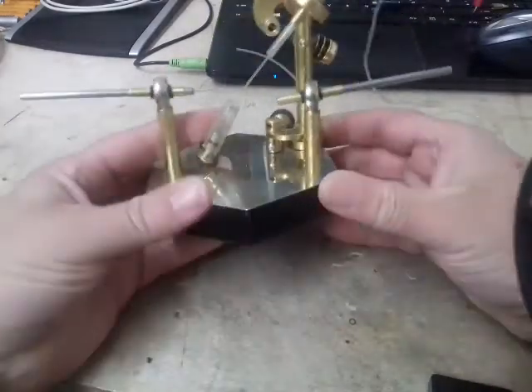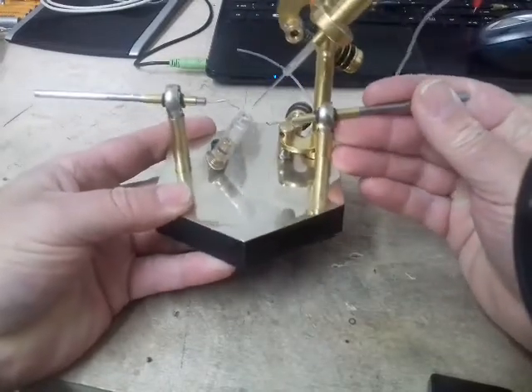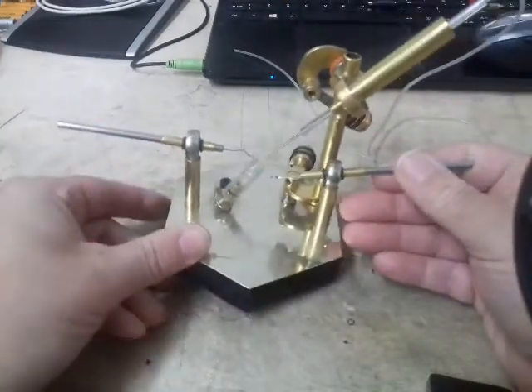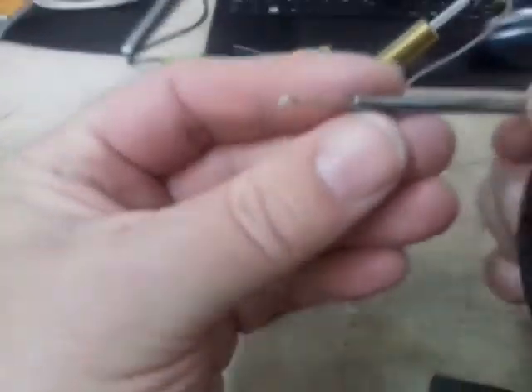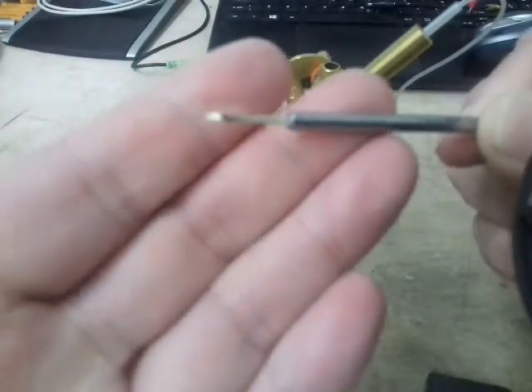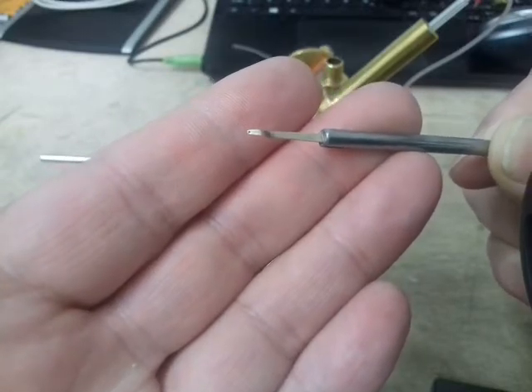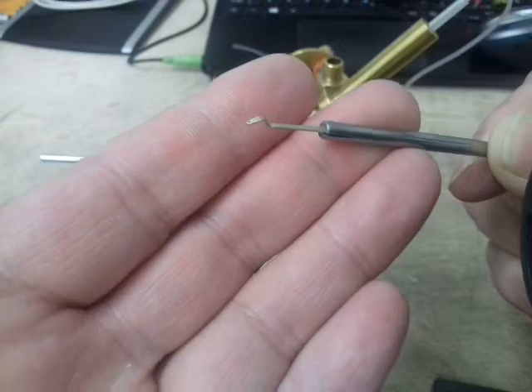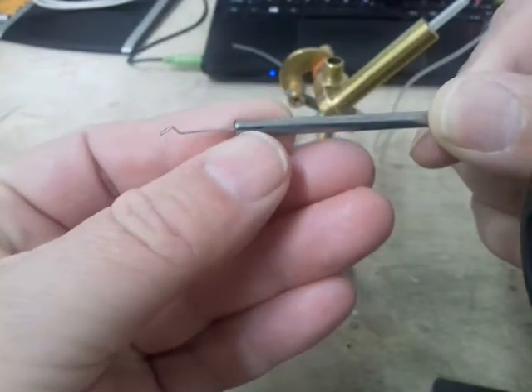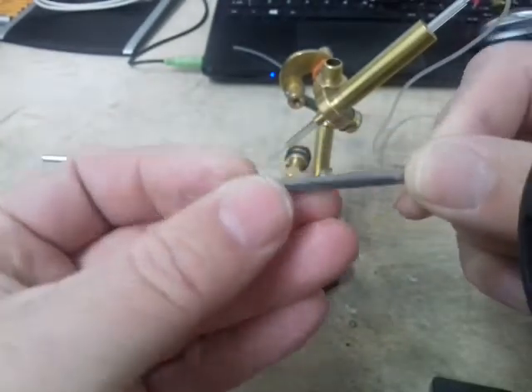As you can see, I've fitted the manipulators from previously. This sting hook itself is a sterling silver piece, I should say, and that's a conventional sting hook with a 0.2mm hole in the end, and it's just simply pushed in between a slot there. A nice press fit so you can pull it out quickly.